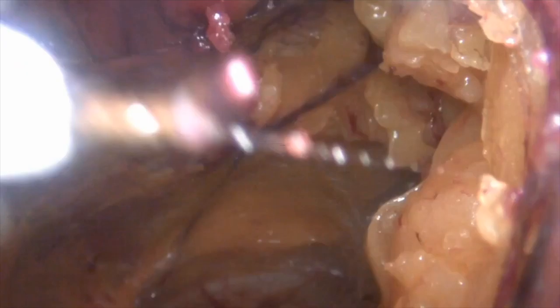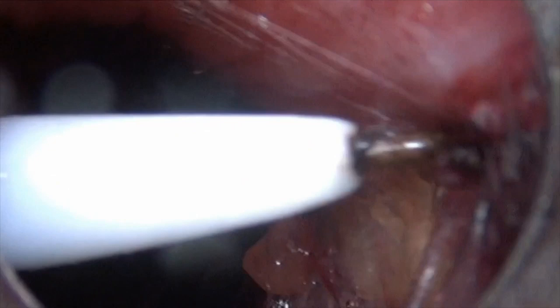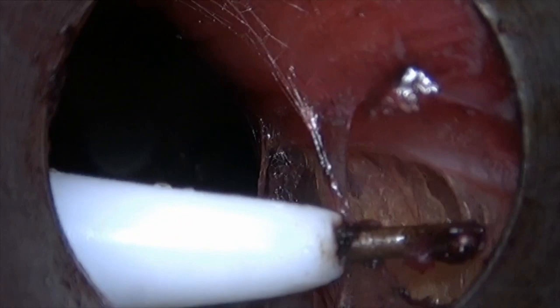So we have to work towards the roof, leaving only a small rim of the fatty tissue over there. And once this fat is brought down, the right retrorectus space would be visible to us, and we can continue with our dissection in that area. So now you can see the fat has been taken down well. So we are just trying to identify the area where the posterior rectus sheath is getting inserted into the linea alba. So this will happen close to the umbilicus.